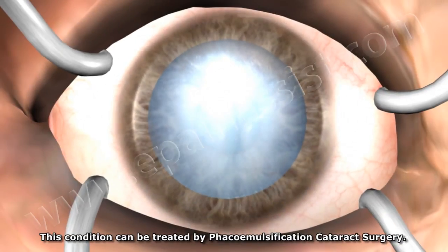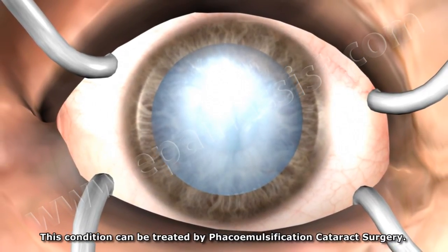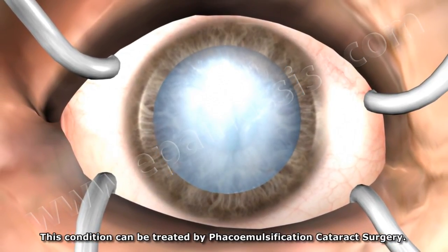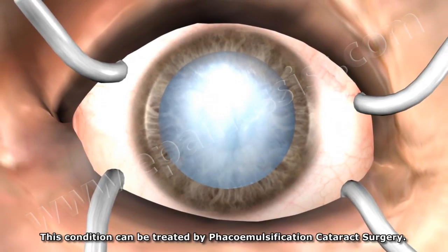This condition can be treated by phacoemulsification cataract surgery.